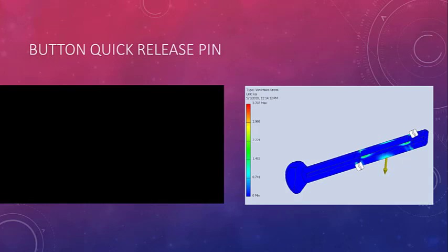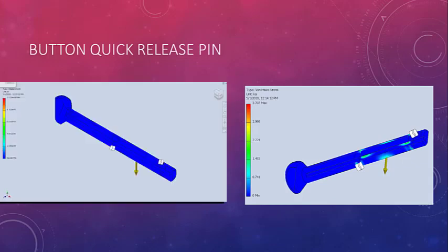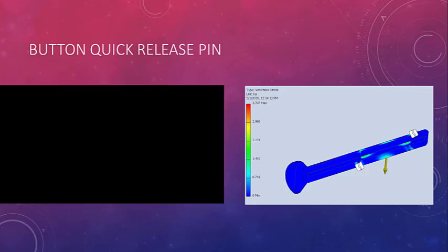As seen here, the quick release pin used for the wheel blocks held up fairly well against 200 pounds of force. On the left, the displacement of the pin can be seen due to the weight, and the displacement is smaller than the thickness of a sheet of paper, coming in at a maximum of 1/10,000th of an inch. To the right, you can see the stress put on the pin coming in at 3.707 KSI.